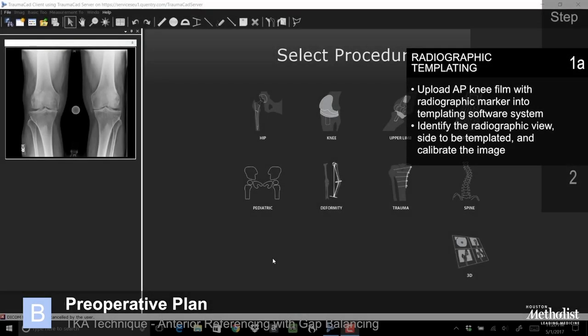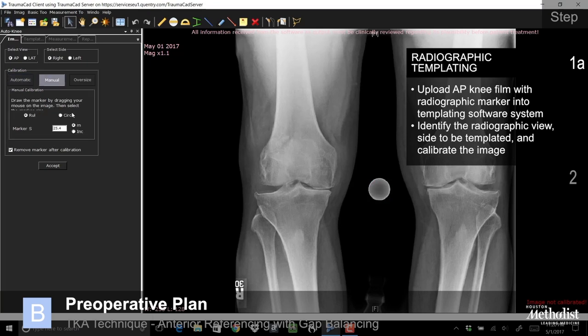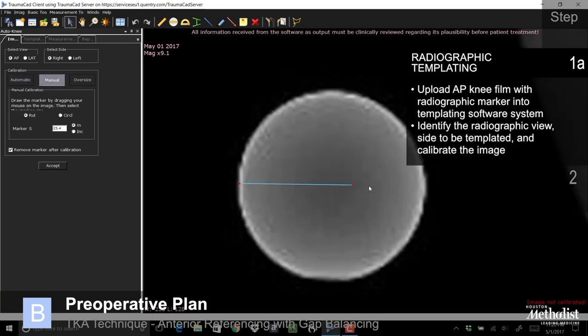Upload the AP knee film with radiographic marker into the templating software system. Identify the radiographic view, side to be templated, and calibrate the image.